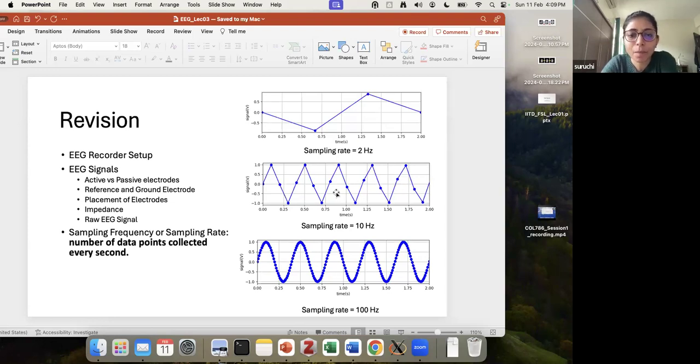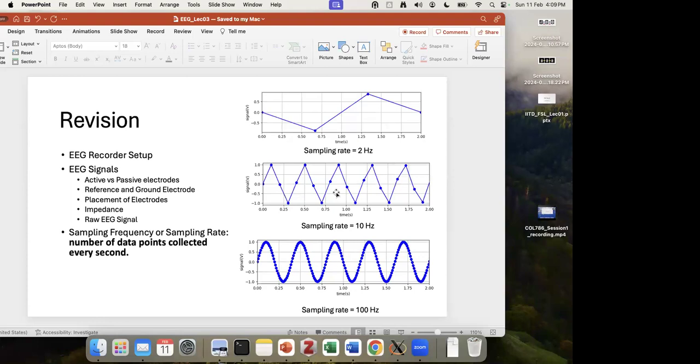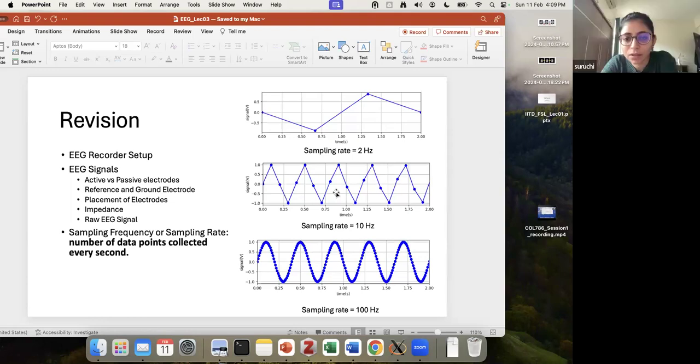Shilpi? Basically, for sampling rate we discussed for every second, like up to 250 samples of measurement. That is one piece of information. Do you understand what sampling rate means? We are trying to understand it deeply. If I made a measurement 4 times in 2 seconds, how many measurements did I do in 1 second?